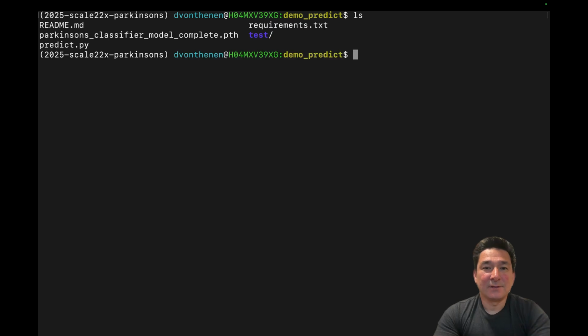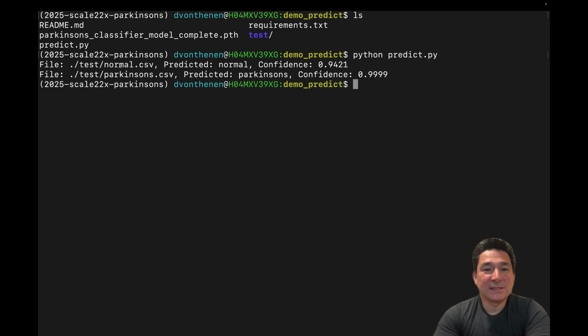Once your model is generated, you can go into the demo predict folder. You can see a completed model that's for Apple Silicon. That's the Parkinson's classifier model complete. And then there's a test folder, which contains two files, one for normal gait and one for Parkinson's gait. They have the CSV files that you're going to pass through the model to give you a classification for each of those types of walking patterns. So if we run python predict.py, you can see that the normal CSV file is predicted as a normal gait with a confidence of 94.21%, and the Parkinson's CSV has been predicted to be a Parkinson's gait pattern at a confidence of 99.99%.